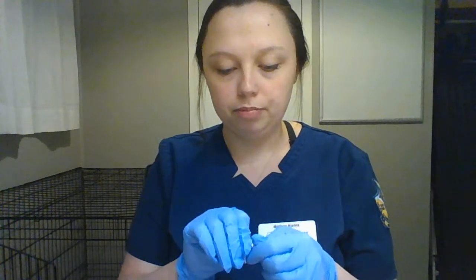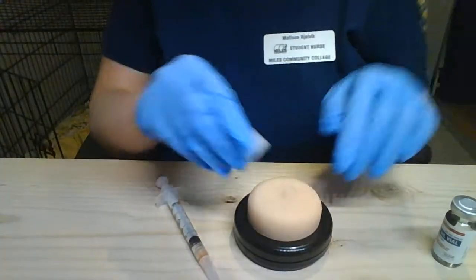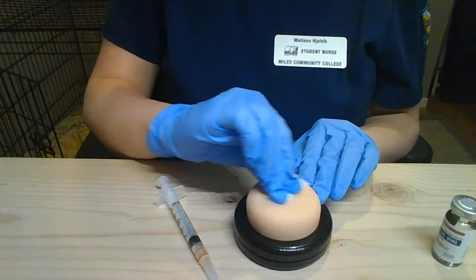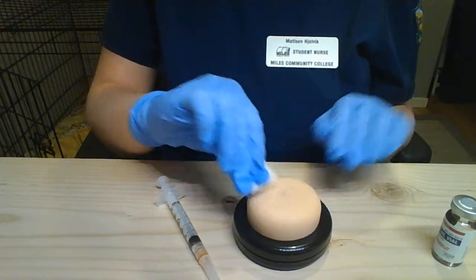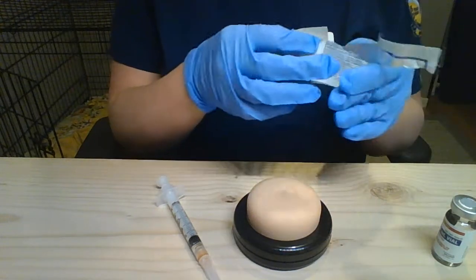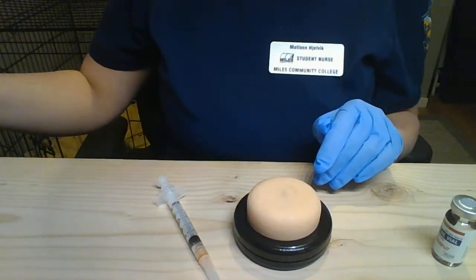Alright, I would instruct the patient to expose their whole upper arm and to either relax their arm at their side or to set it on a table or something so it's relaxed. I'm going to take an alcohol swab and clean the area in a circular motion, working inward and going outward in a circular motion.